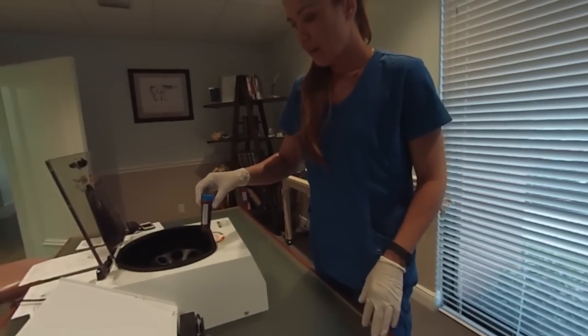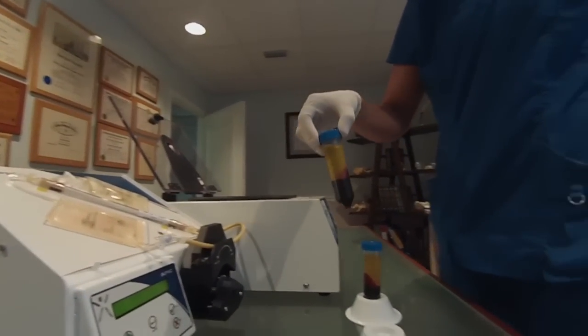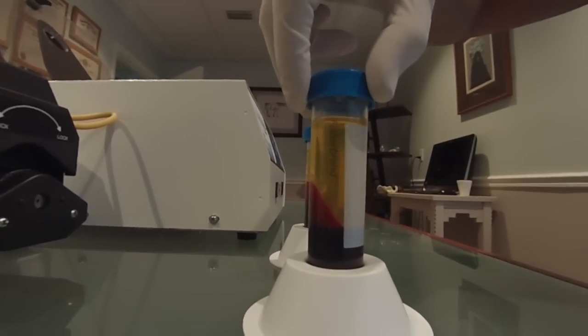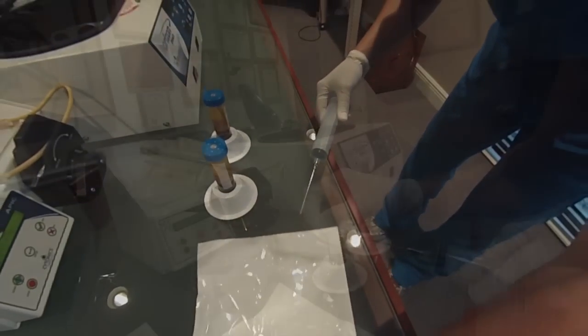Carefully load the tubes into the centrifuge. Close the lid and lock. When the cycle is complete, remove the tubes and place in the rack so the wall of red cells is facing away from you. Remove the metal plasma collection needle from the sterile packaging and connect to the 60 mL syringe provided in kit number two.